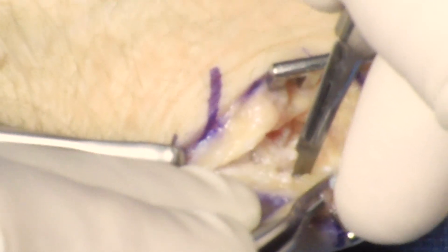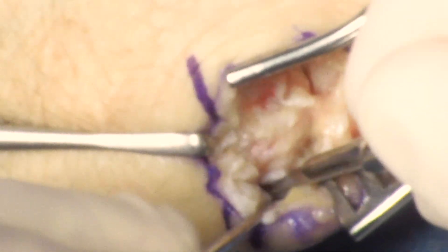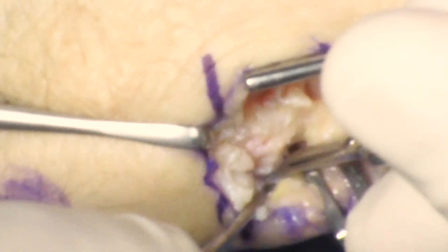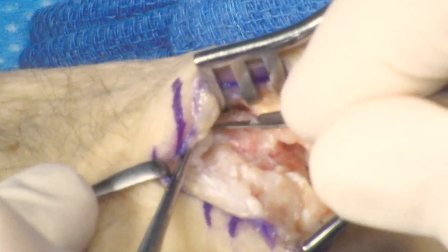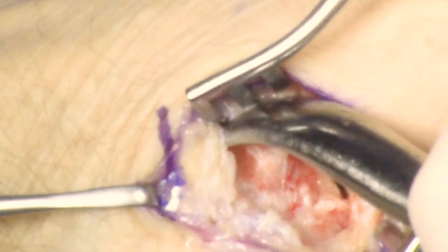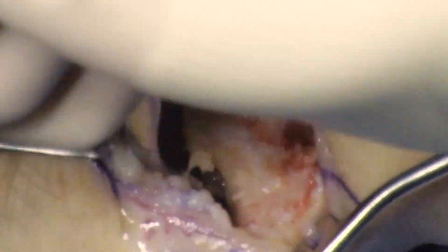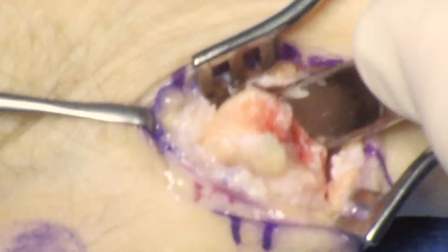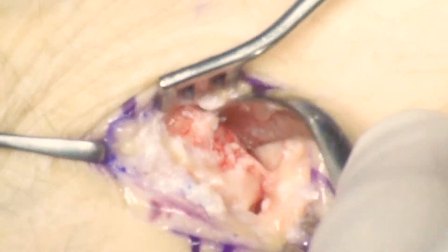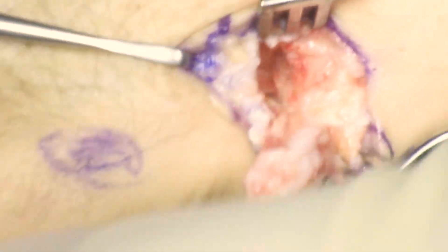The scaphotrapezial joint is entered. A freer is then used to retract the first metacarpal. It's important to go around the corner on both the scaphotrapezial joint and the trapezium first metacarpal joint. The freer is then placed distal and ulnar to release that corner. The trapezio-trapezoidal joint has to be completely released as well. A McGlamrey elevator is excellent for removing carpal bones — start distal ulnar with more of a levering action as opposed to a pushing action. Sometimes the trapezium will pop out on its own; sometimes you have to use a rongeur. A twisting action will break up any remaining soft tissue attachments.